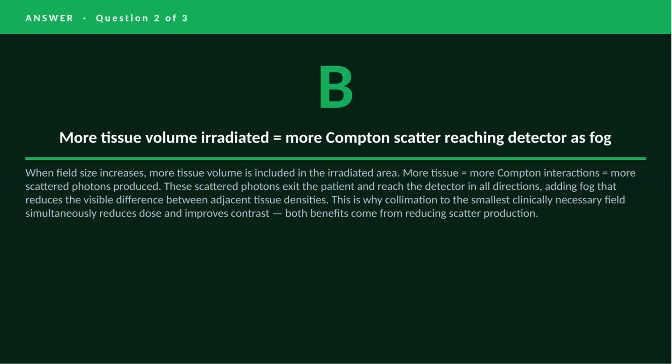That is how a larger field directly degrades contrast, and it is exactly why collimation simultaneously improves contrast and reduces dose from the same single action.